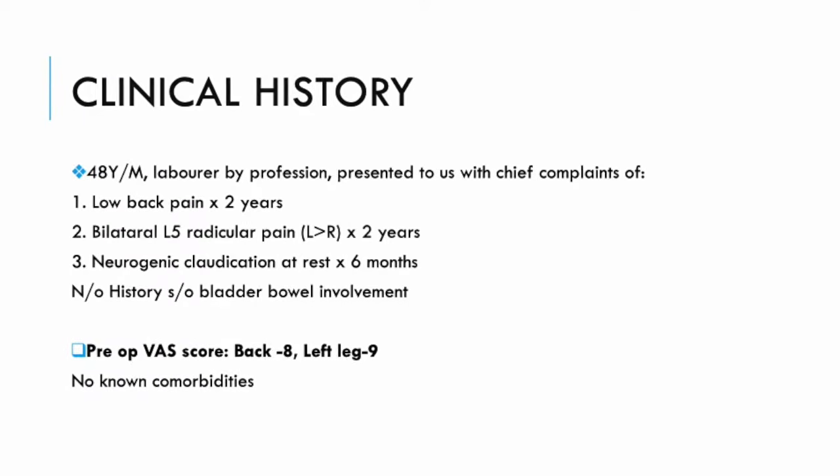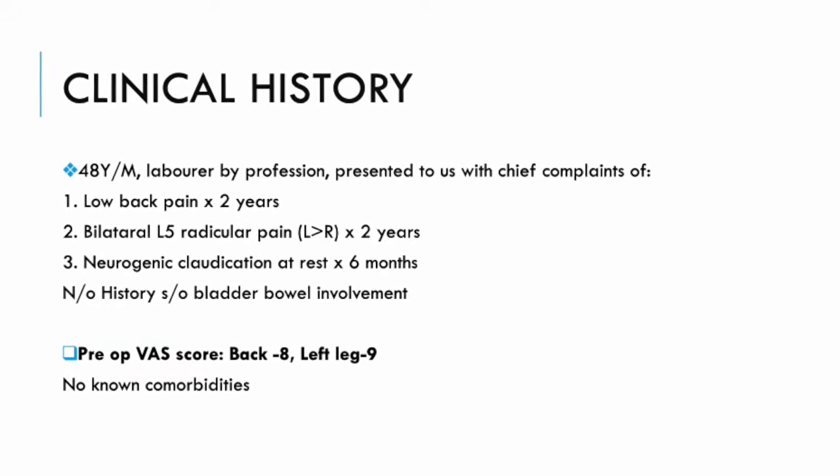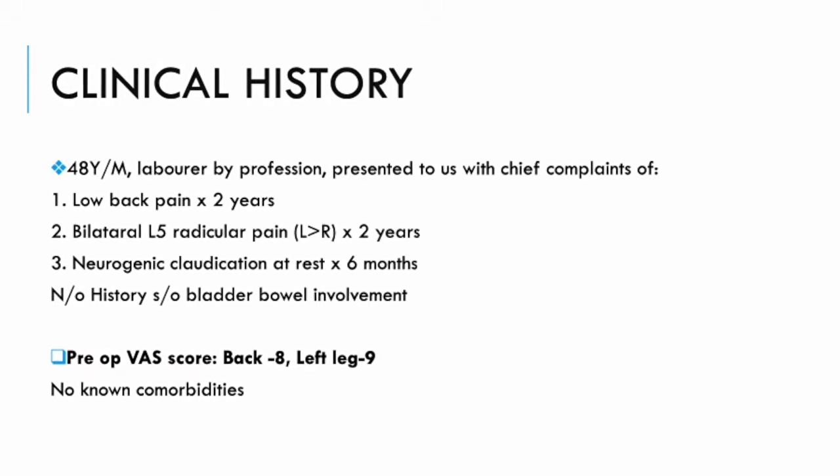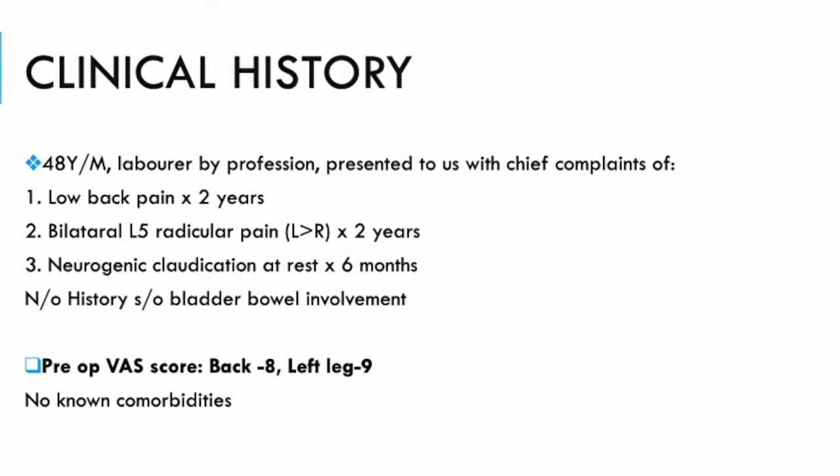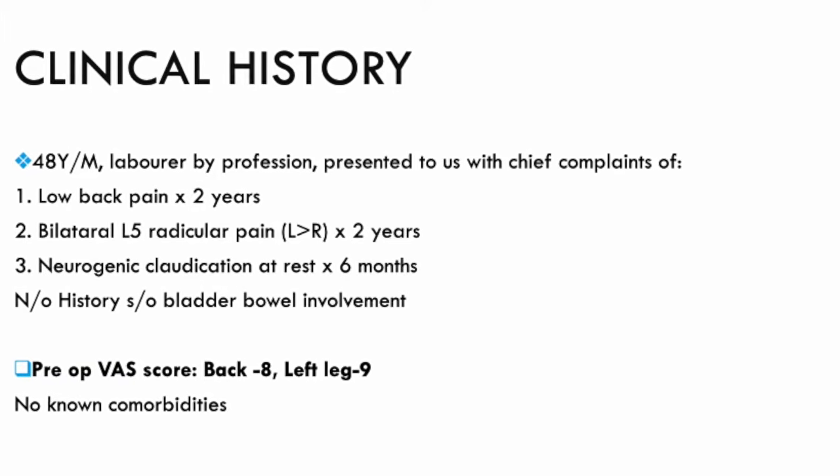This operative video showcases the contralateral sublaminar approach performed using a unilateral biportal endoscopy for the management of a calcified lumbar disc herniation. The patient is a 48-year-old male who presented with chronic low back pain. He had bilateral L5 radiculopathy, more pronounced on the left side, and features of neurogenic claudication for over 6 months.